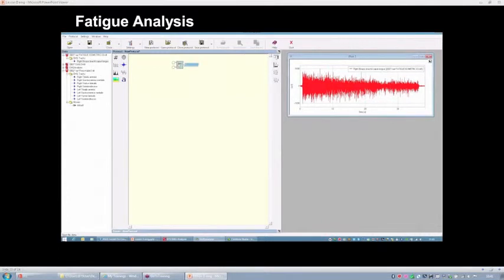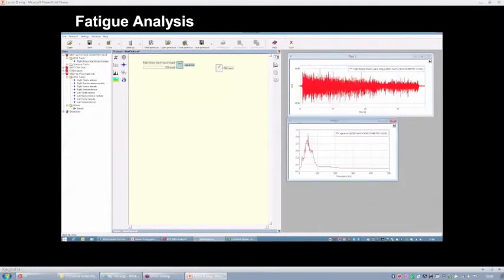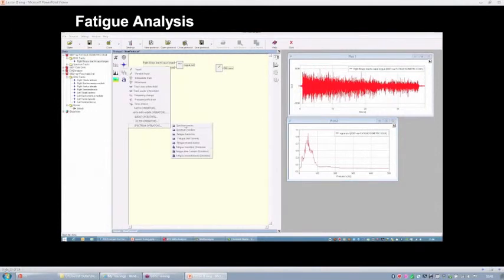So now I want to start by computing the power density spectrum of the signal, and I want to show you the shape. So this is the duration of the time window. Okay, and this is the spectrum, and as you can see, it is shifted to the left with respect to a typical spectrum, if you remember.